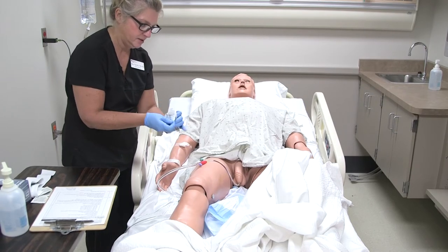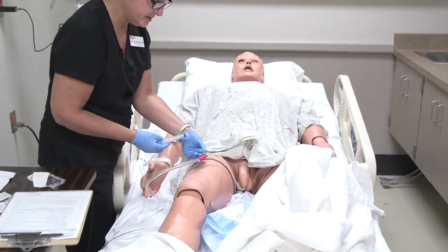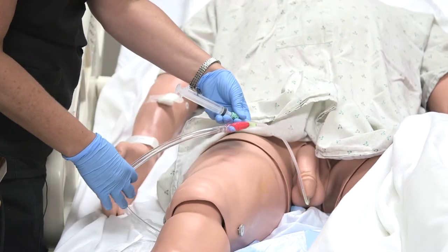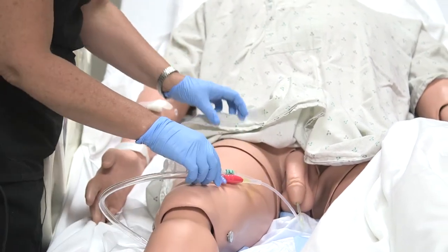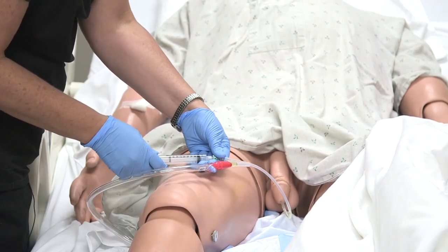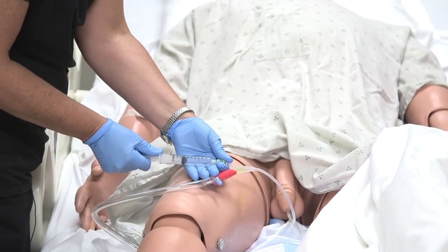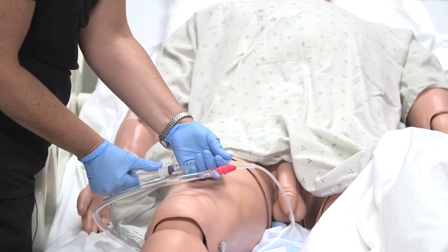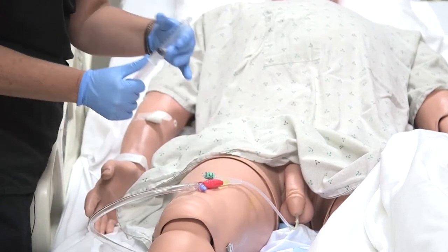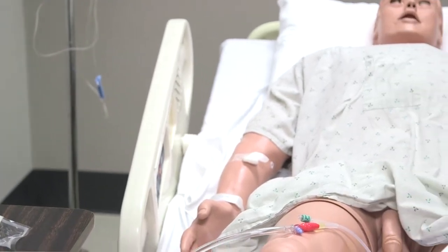That's always a trick. I'm going to put the syringe on the balloon area because that's where our water is. We want to deflate that balloon before we pull this out, because you wouldn't want to pull it out with the balloon still inflated. You shouldn't feel this at all, but I'm just going to remove the amount of fluid that I put in. You should get near 10 cc's.